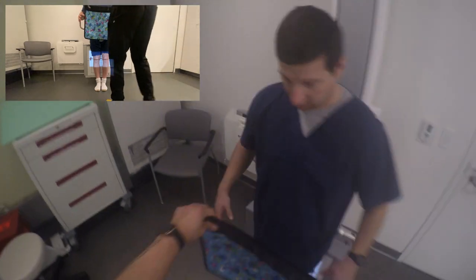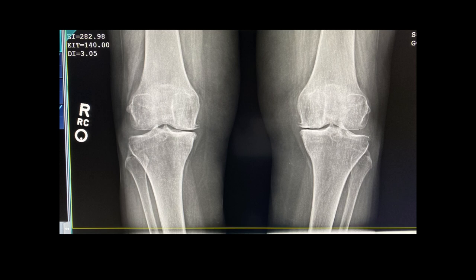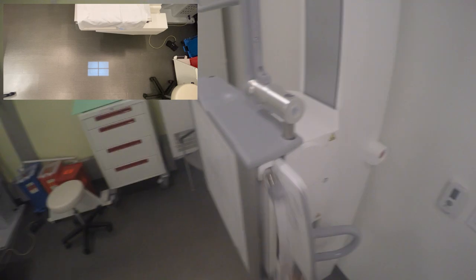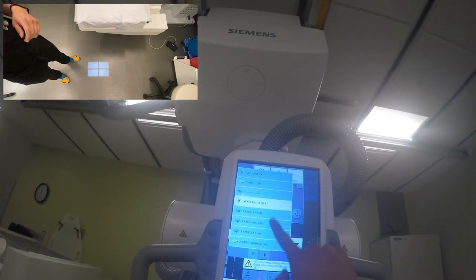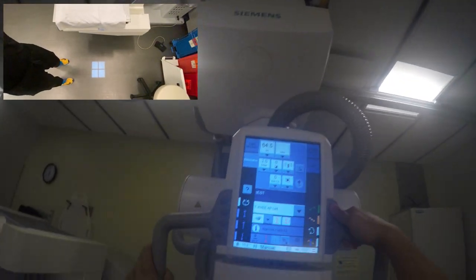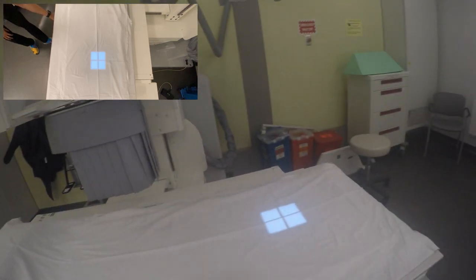Hold it a little bit — check the family jewels. Okay, so now we're going to do the rest of the exam on the table. How's your day going? Good, not too bad, just got the knee pain. Any questions so far? No. We're almost done here — thanks for being patient. No problem, thank you.